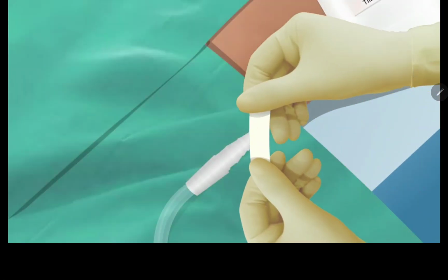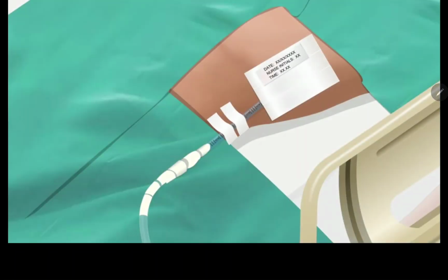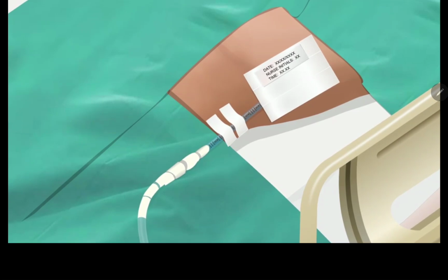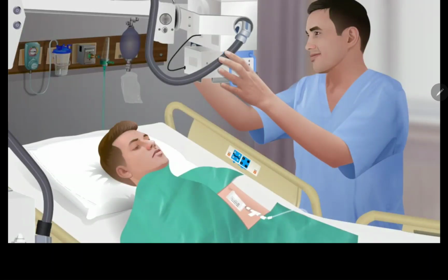Tape all the connection points between the chest tube and the chest drainage system. Secure the chest tube to the patient's skin below the dressing, using a tube securement device or tape. Ensure that a chest radiograph is obtained.